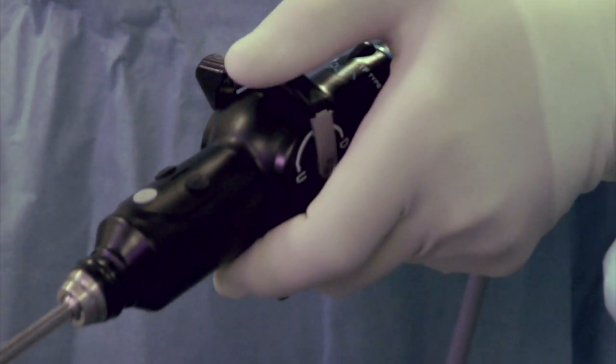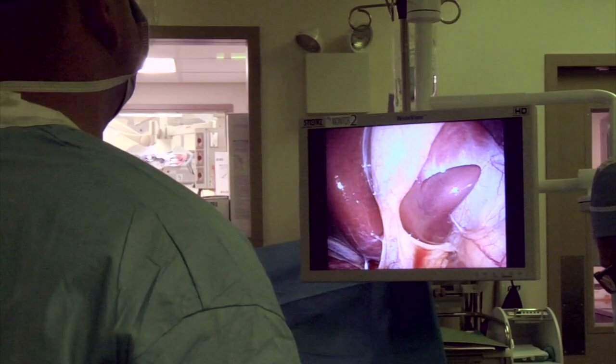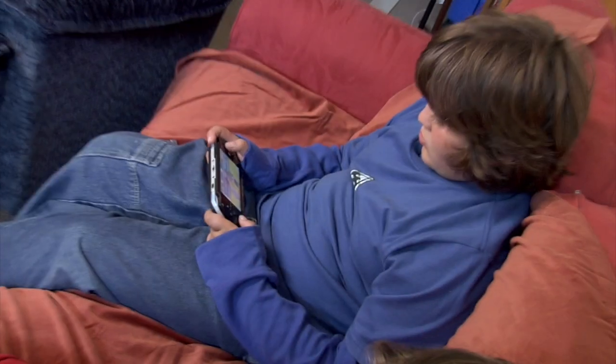When performing these operations, surgeons manipulate surgical tools with a handheld controller, similar to those used for video games, and they watch the action on a television screen located away from the patient. But that doesn't mean that anyone with their own copy of Staying Alive, Arduous Surgeries, Volume 2 is a qualified laparoscopic surgeon. It's a technically complex surgical approach, and surgeons must complete a 1 to 2 year fellowship training in laparoscopy, in addition to their basic surgical residency. And they don't do laparoscopic surgery just anywhere in the abdomen. They specialize, such as in liver and gallbladder surgery, or vascular surgery, or colon surgery.